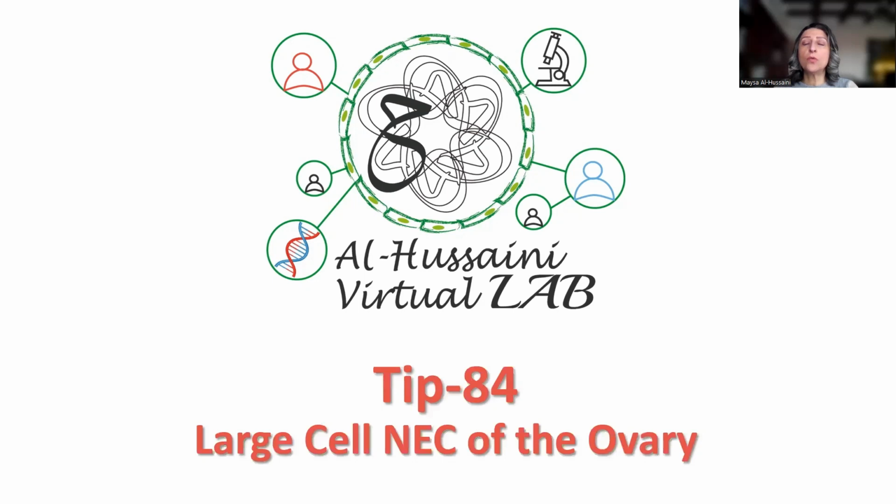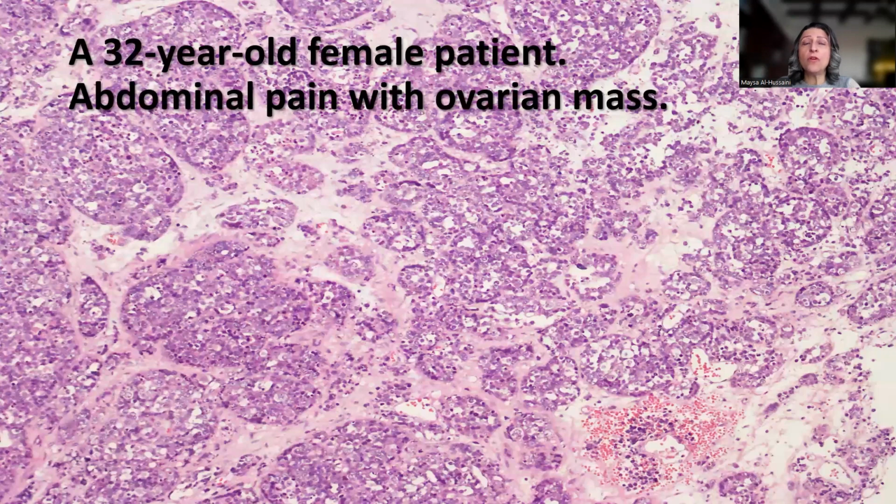What I'm going to be sharing with you today is a nice case of a rare tumor occurring in the ovary, which is large cell neuroendocrine carcinoma of the ovary. So this is a case of a 32-year-old female patient who presented with abdominal pain and was found to have an ovarian mass. And as you can see from the low power magnification, there is a tendency for the tumor to grow in nests, in groups, in islands, separated by some edematous stroma, as well as a little bit of hemorrhage, and perhaps here some areas of necrosis.